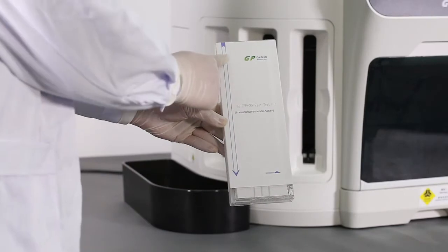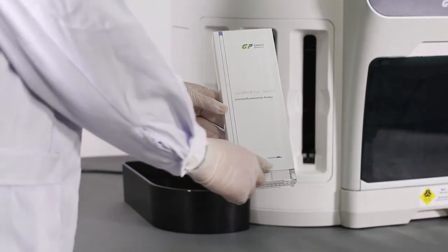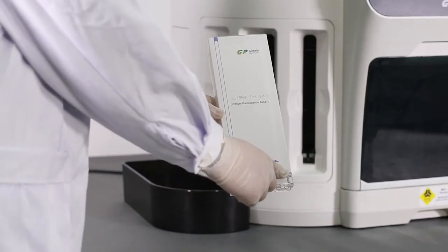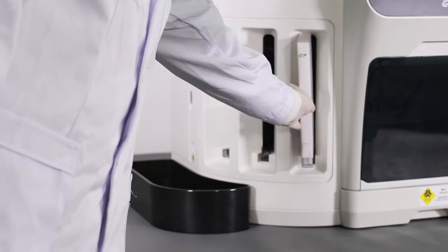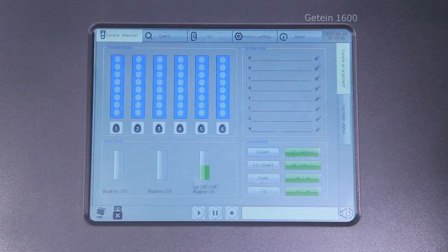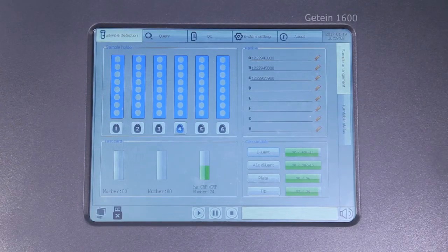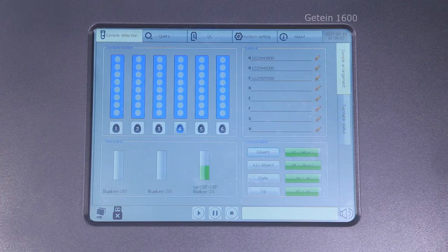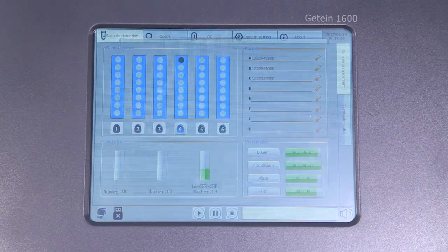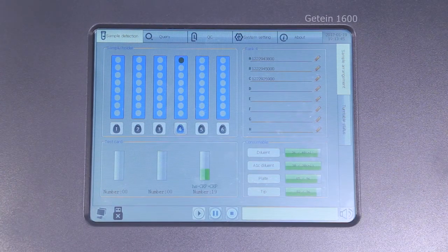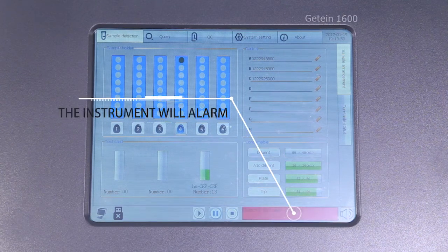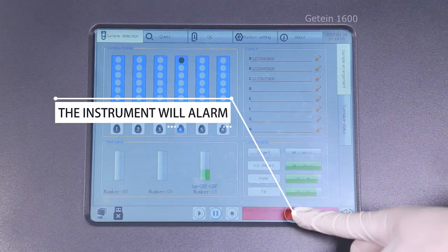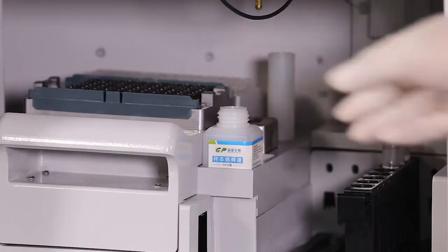Insert the strip holder following the directions of the arrow and push it in to the bottom. Meanwhile, confirm the information of the item and quantity on the screen. The instrument will alarm if the supply runs out. Click the corresponding area and supply the consumables according to the alarm.